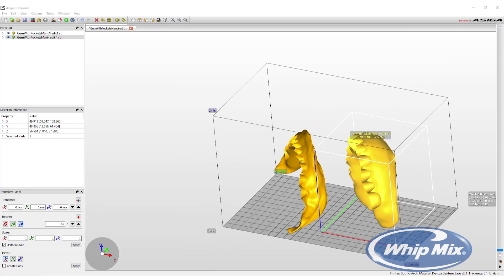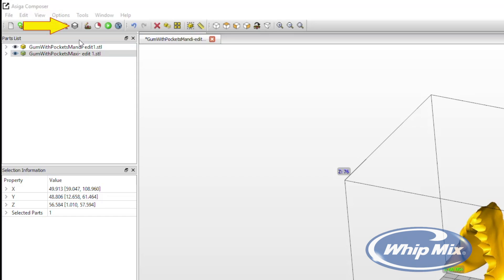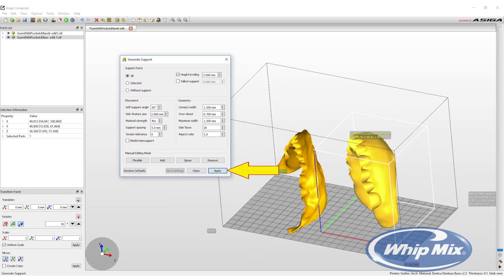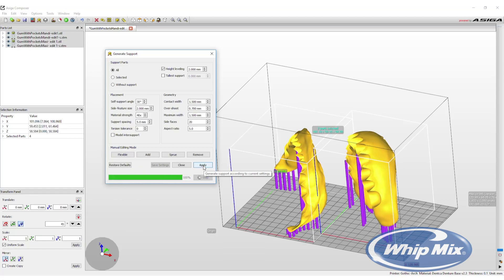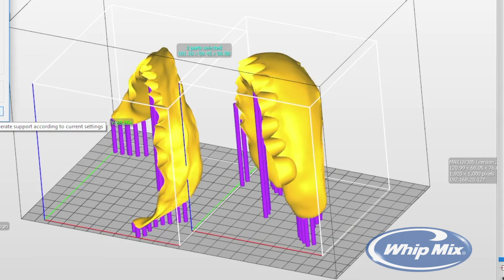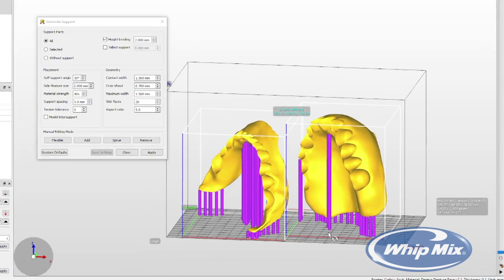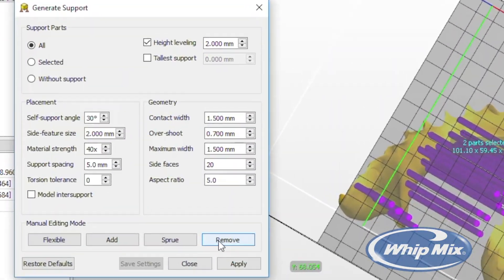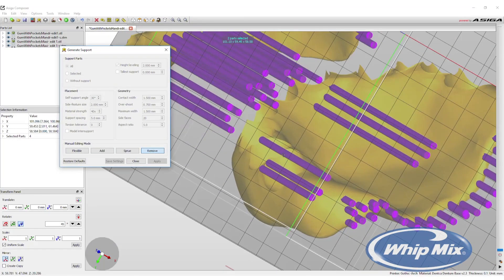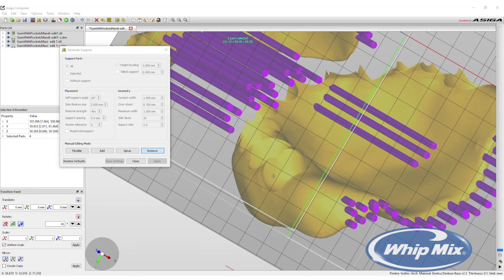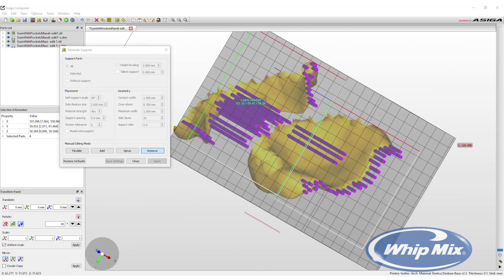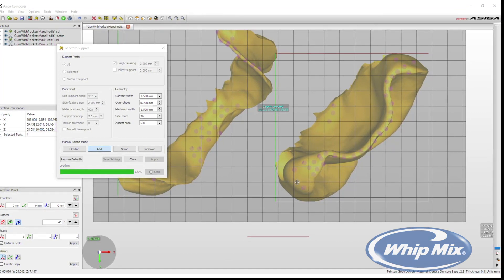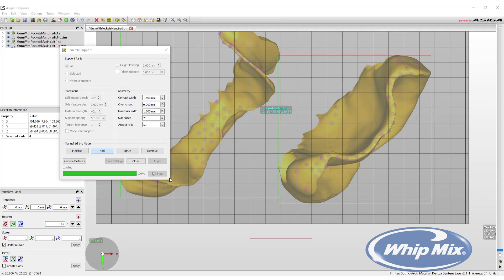The next step is to add supports to the denture base designs. In the upper toolbar, select the Generate Support option. The default settings work well for most projects — just press Apply. It will locate all overhangs that need to be captured to print the build properly. Sometimes automatically generated supports can interfere with tooth placement. To avoid this, click the Remove button in the Generate Support menu and click on the supports to delete them. To add supports, click Add and click where the support should be placed. Adding extra supports where the denture meets the build plate adds strength so the denture does not shift during printing.